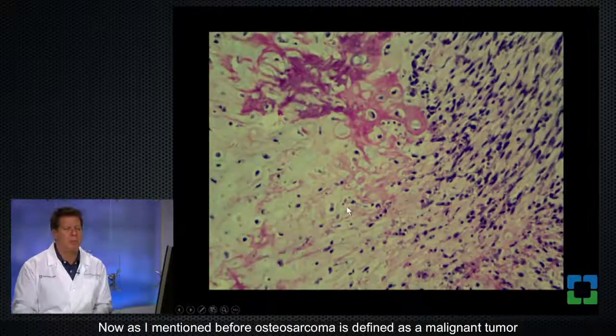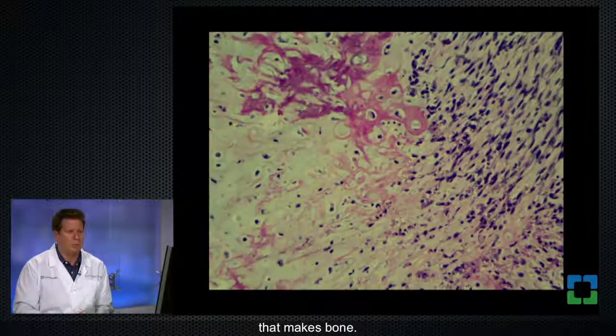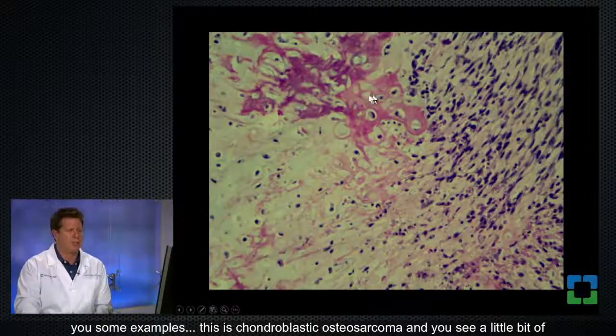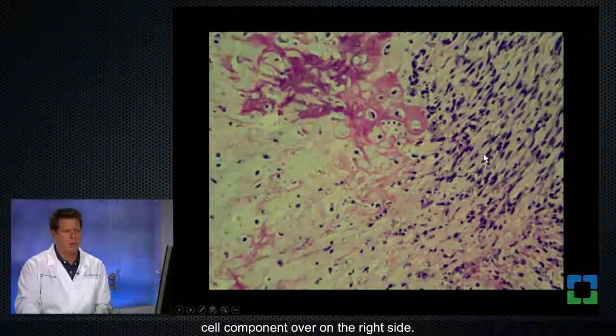Now, as I mentioned before, osteosarcoma is defined as a malignant tumor that makes bone. And for that reason, that means it can produce other matrices as well. And just to show you some examples, this is chondroblastic osteosarcoma, and you see a little bit of osteoid over here, but you also see the chondroid matrix, and here is the malignant spindle cell component over on the right side.